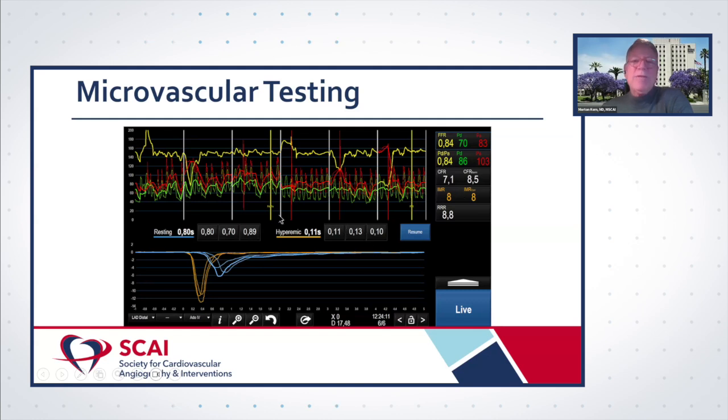It's unusual to have a coronary flow reserve of 7 in a middle-aged man, post-bypass, with significant risk factors, endothelial dysfunction, and now he has a hugely normal CFR. What do you make of this?